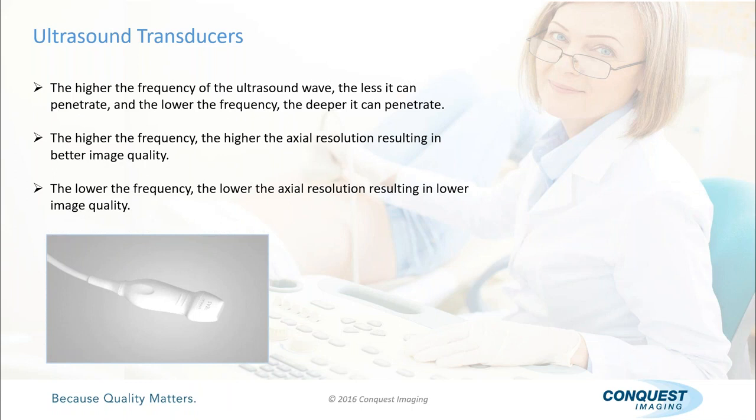Now, they have 33 megahertz probes out there now, which is unheard of. And they only go, you know, 1.5 centimeters, 2 centimeters into the human body. They're very surface oriented. The image is amazing, but Canon makes those, just so you know.